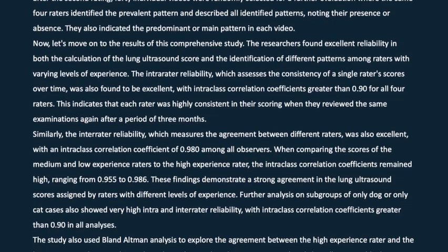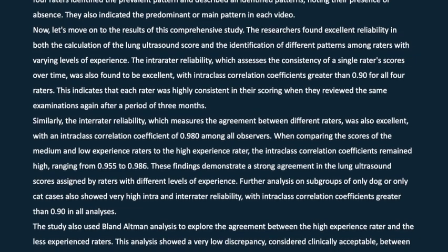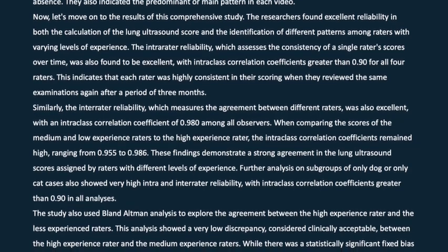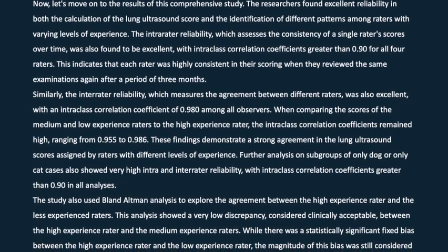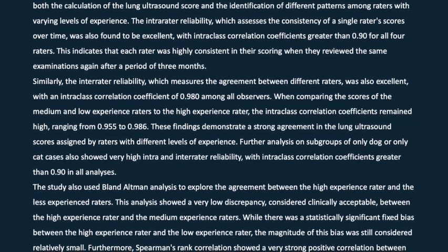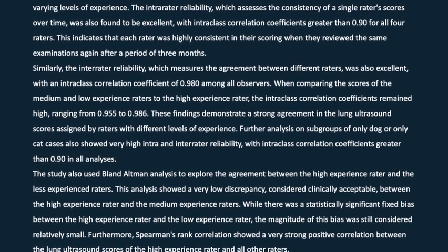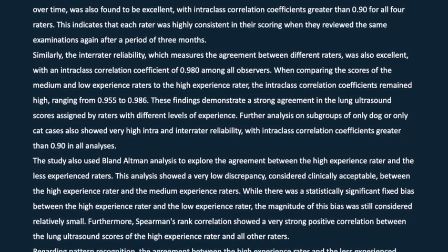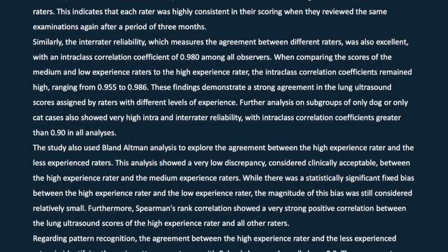This indicates that each rater was highly consistent in their scoring when they reviewed the same examinations again after a period of 3 months. Similarly, the inter-rater reliability, which measures the agreement between different raters, was also excellent, with an intra-class correlation coefficient of 0.980 among all observers. When comparing the scores of the medium and low experience raters to the high experience rater, the intra-class correlation coefficients remain high, ranging from 0.955 to 0.986. These findings demonstrate a strong agreement in the lung ultrasound scores assigned by raters with different levels of experience.